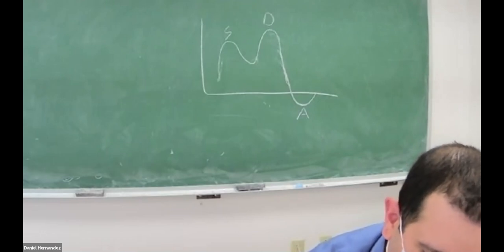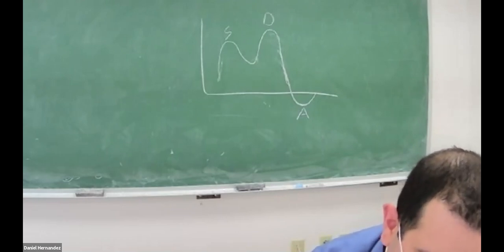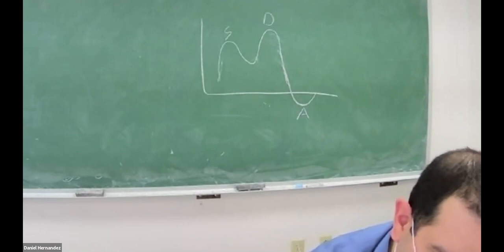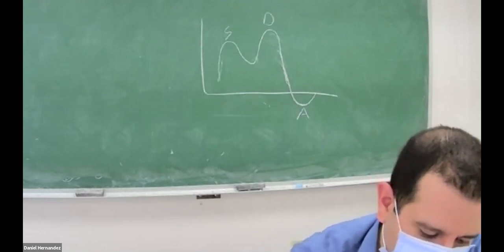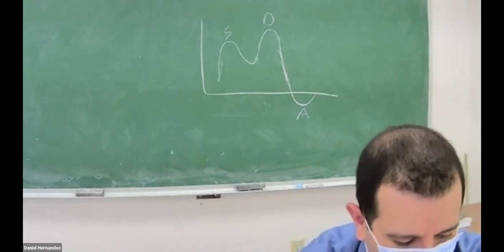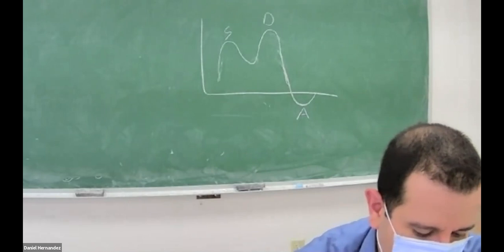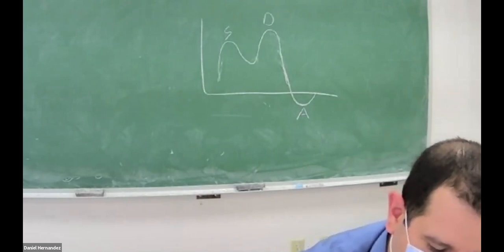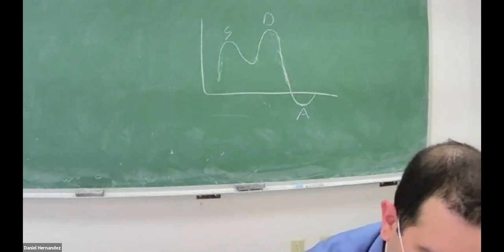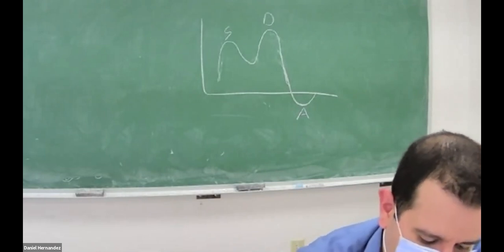Which of the following is one of the first two-dimensional image findings associated with aortic regurgitation? We have thickened aortic valve, left atrial enlargement, left ventricular enlargement, or left ventricular hypertrophy.